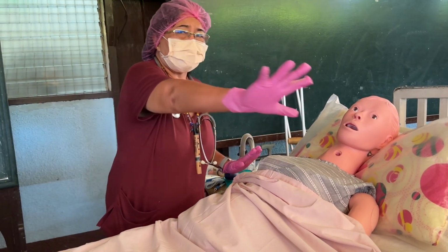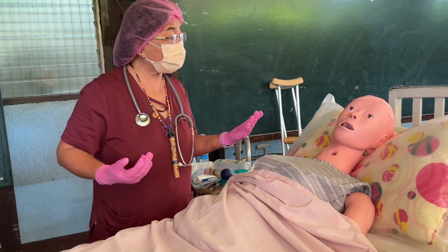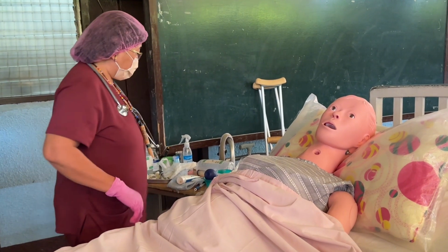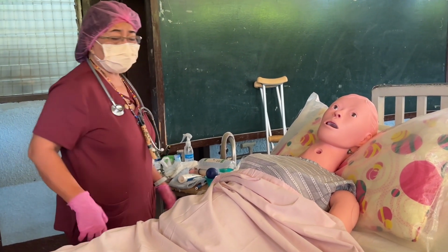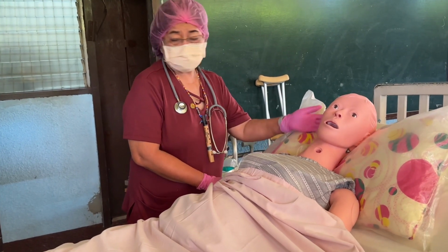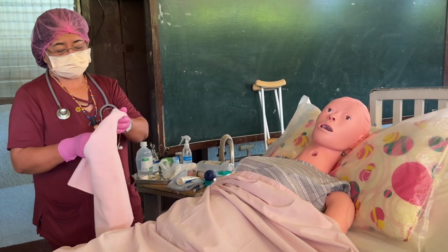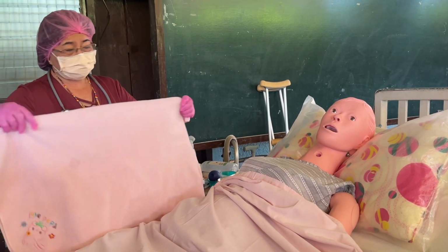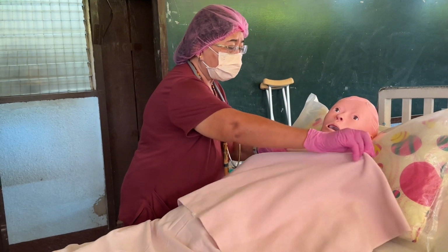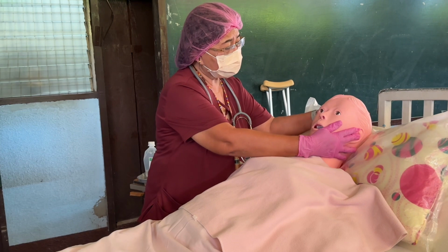Yes? Go ahead. Draw the curtains, then offer a bedpan. Ma'am, do you want to defecate or urinate? You don't feel like doing it. Okay, then ma'am, I'm going to start now. So if the patient is away from you, you have to pull the patient near you, but I think she's near me already. So put first a towel over the patient's chest to avoid soiling or wetting the garments. And then ma'am, kindly turn towards here, ma'am.